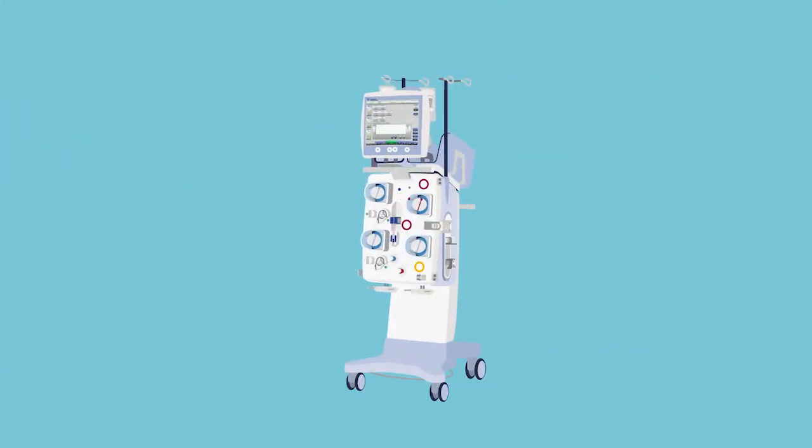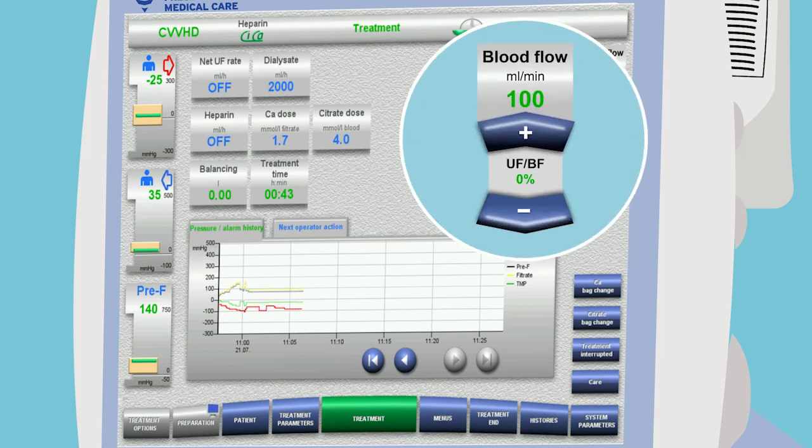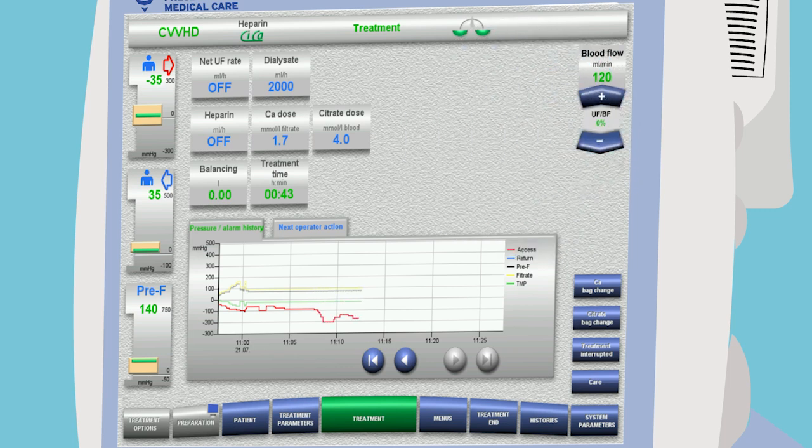In FMC acute dialysis machines, the citrate calcium anticoagulation is controlled via elaborate software. This also controls the coupling between the multiple pumps for matching flows of the different solutions. All processes can be monitored and individual adjustments can be made via the user interface.